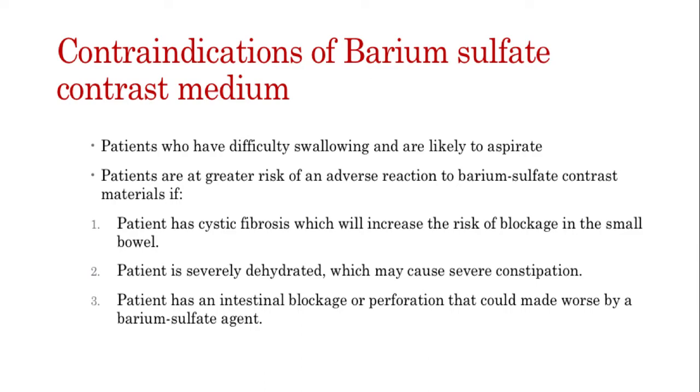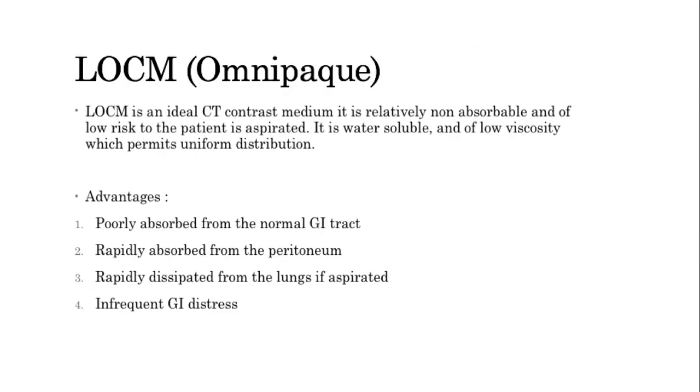If the patient just had a surgery within the digestive system, a very recent surgery, sometimes the area of surgery is not ligated properly and the barium can leak. So these are contraindications where the clinician does not send the patient to have a barium scan.